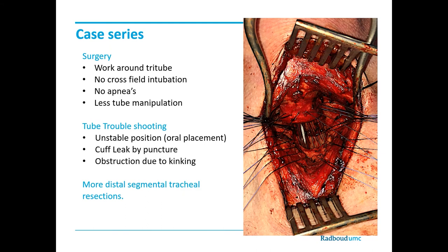In most of our cases, it was possible for the surgeon to work around Tritube without the need for tube exchange. In 7 out of 8 cases, it was possible to complete the tracheal anastomosis with Tritube in situ, and we think that's a very good result. Also, the surgeons were very happy with that, because there was no need for cross-field intubation. Of course, we also had some troubleshooting, as we presented in the case as well.